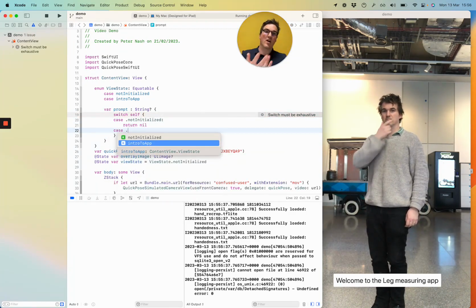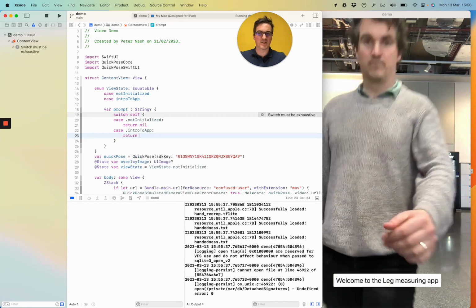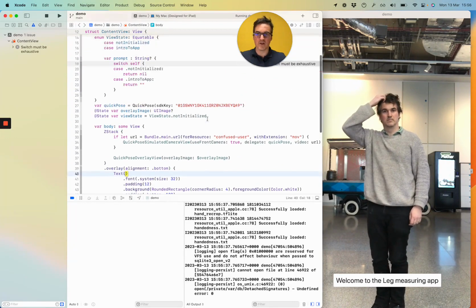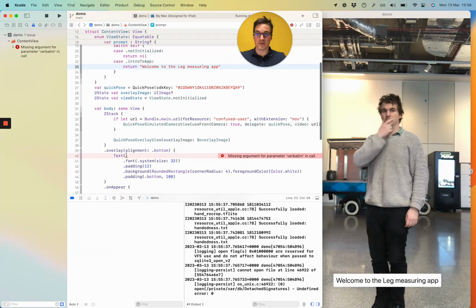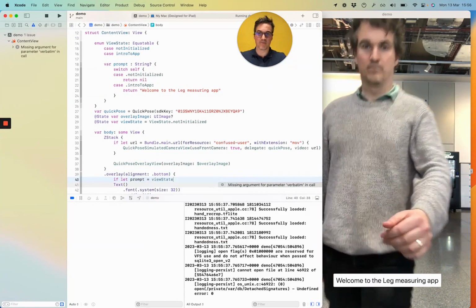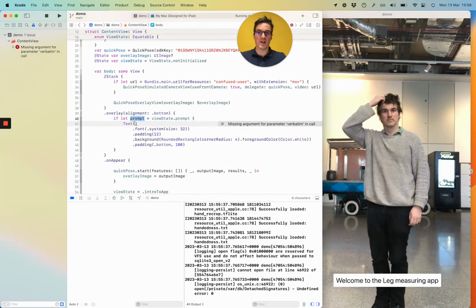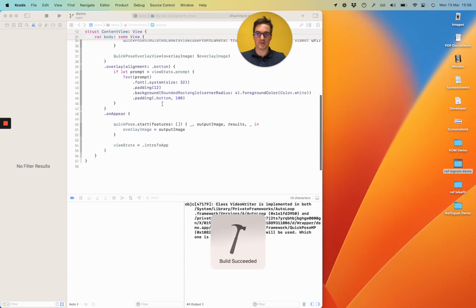And some of you might be like, oh, why use a switch? Because it gives you a prompt to say, oh, you've missed a state. And for things like this in UI, it's good to have a very explicit state because people can join the project and so on and not realize what your initial intent was. So we've got welcome to the leg measurement app. Because this is optional, we can't put it directly into here, but we can do something like this. So we're saying if there is a prompt, show it. But we only have a prompt for the intro to app step.